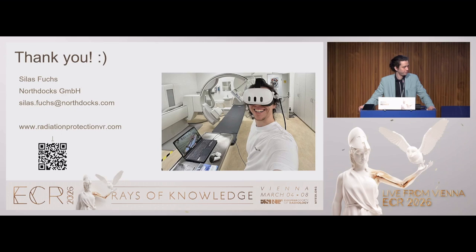So you can play with the angulation, with the typical arrangement of the system, with the pulse rate, and with the dose, but not with everything a new machine has. But it visualizes what they only know theoretically, and which you never see. And what you see and visualize, you remember a lot better than what you read or someone tells you.